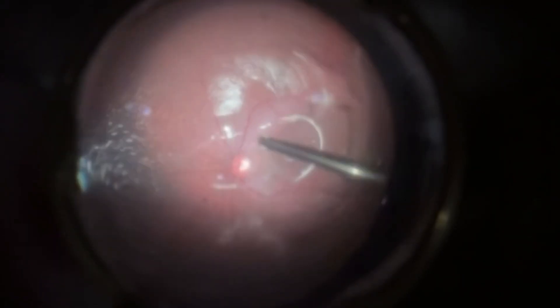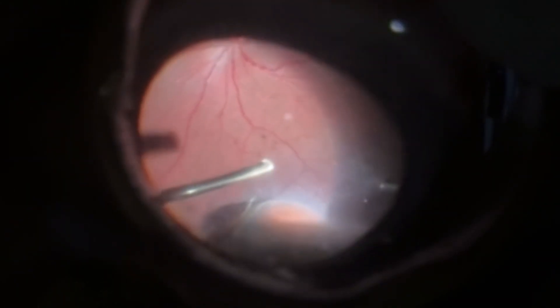The posterior hyaloid detachment is carried out. Vitreous base shaving is then performed. At this point, the surgeon decides to perform endolaser on areas of peripheral retinal degeneration.